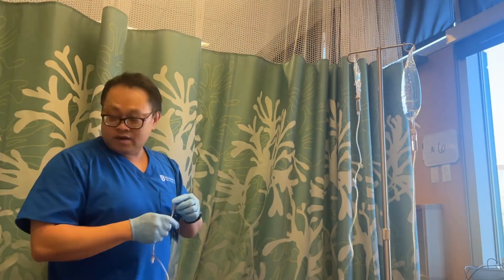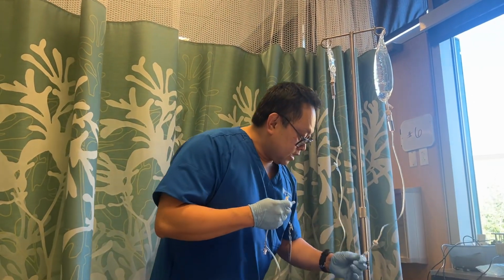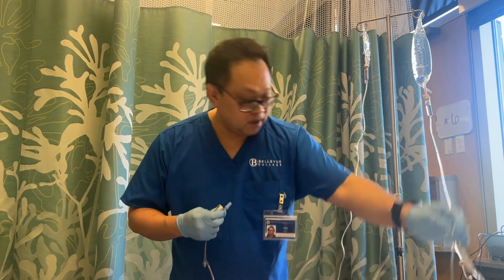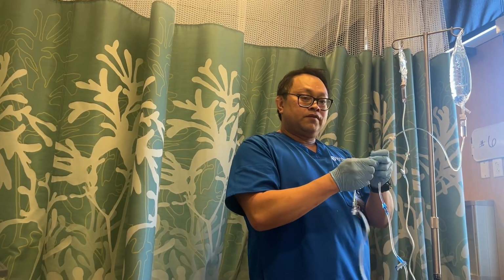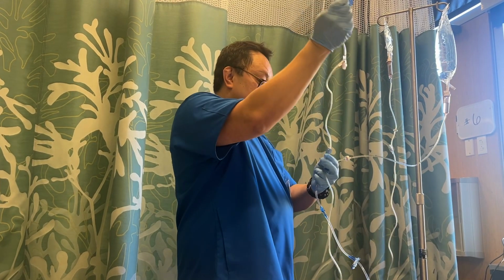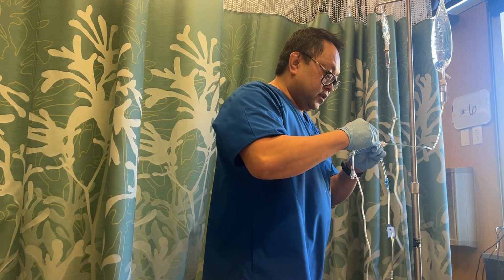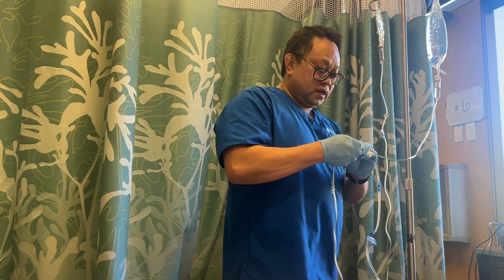Okay, so again, I'm going to take this. So I would scrub the hub for 15 seconds, let it dry for 5, and I made sure earlier that it's locked so we don't waste any medication. Okay. And I'm going to connect this. All right. Okay, so it's connected.